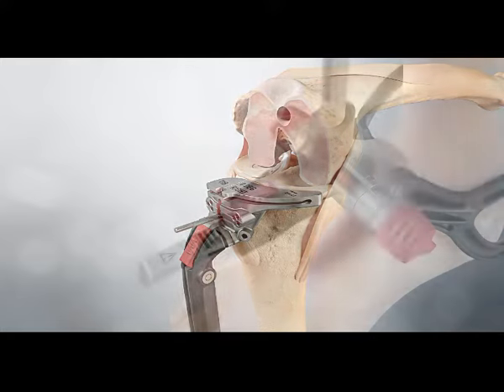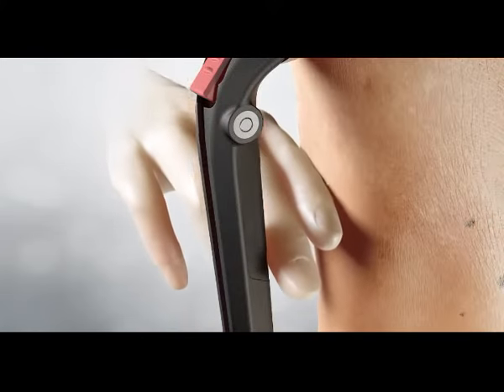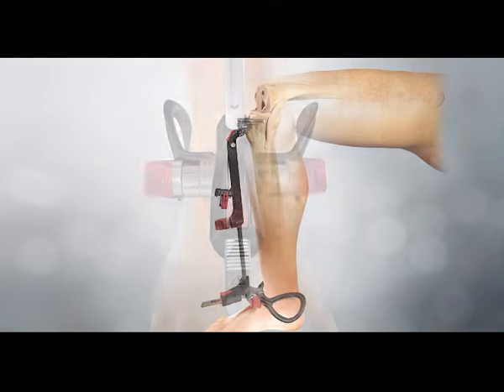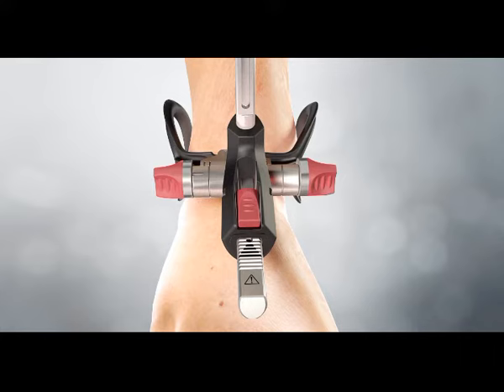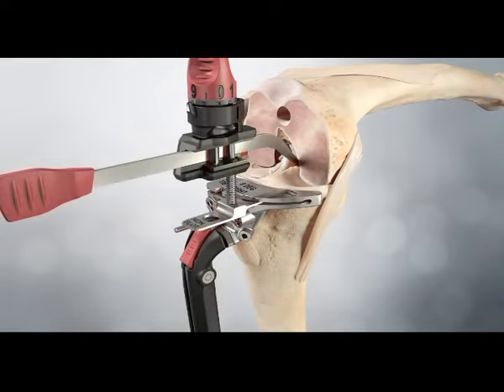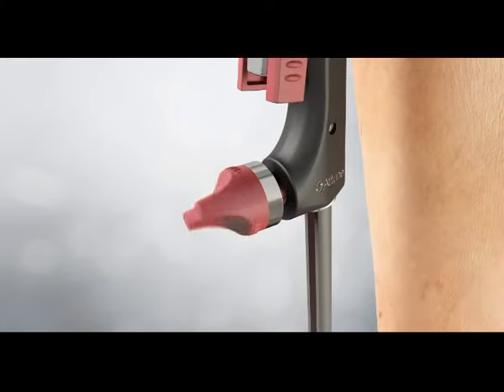The distal uprod is positioned parallel with the axis of the tibia using the ratchet at the ankle. Positioning can be checked by running two fingers between the uprod and the anterior face of the tibia. The varus valgus adjustment mechanism aligns the proximal uprod parallel to the long axis of the tibia. For many patients, this involves translating the adjustment mechanism until the second line from the lateral side of the ankle clamp lines up with the indicator line. The adjustable tibial stylus is attached to the cutting block through the slot feature. The knob sets the resection level on the stylus. The composite thickness of the thinnest insert and tibial tray is 9mm. With the pointer of the stylus positioned in the desired location, the height adjustment knob is locked.